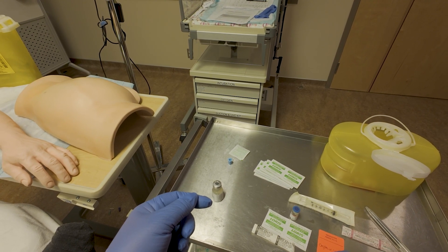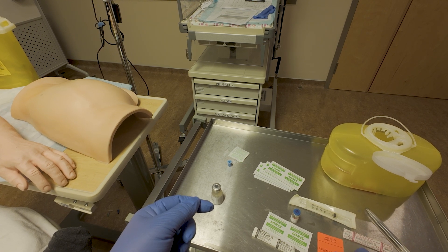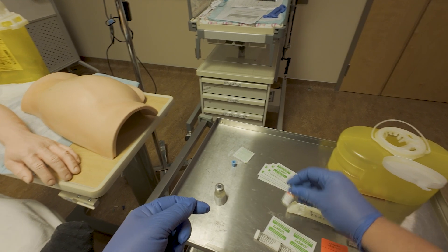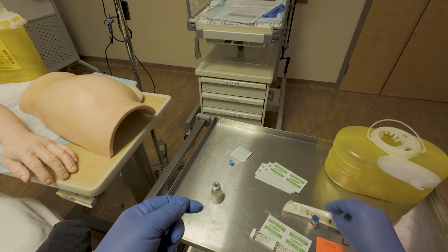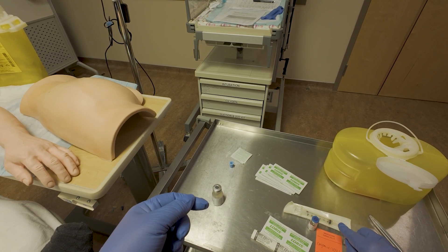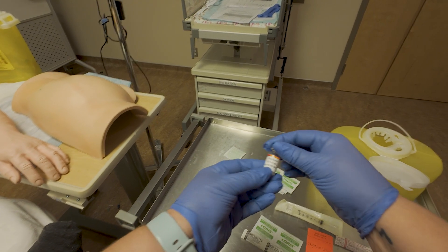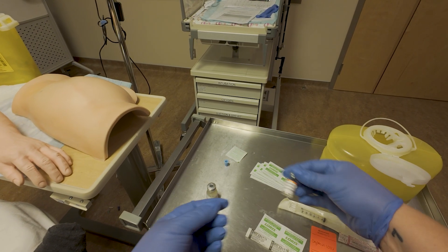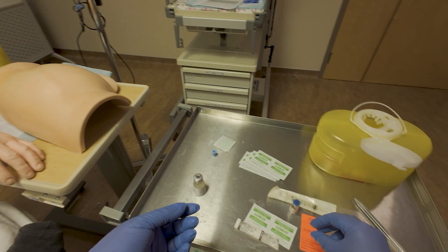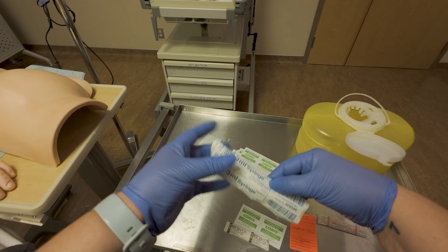We have a medication label because we do draw up oxytocin prior to medication administration. It's important to have a label on it. If you're the person who drew it up, ensure that you put a label on it so that you can leave it bedside with the empty vial, so that anyone who comes in the room knows you have drawn up oxytocin into the syringe and can look at your empty vial to ensure the medication isn't expired and that it is the correct medication.